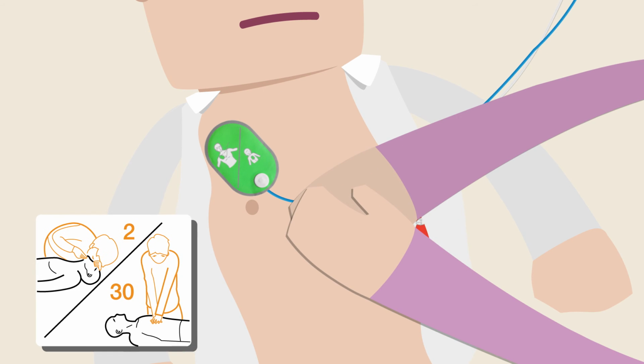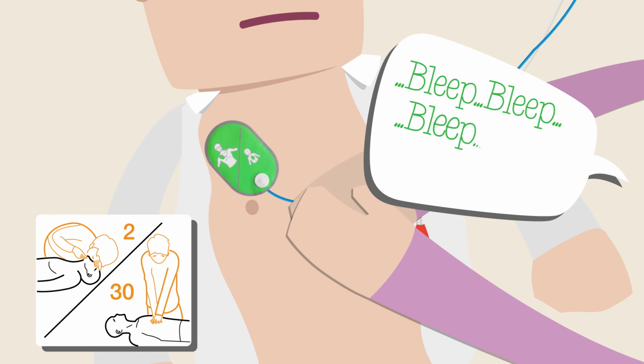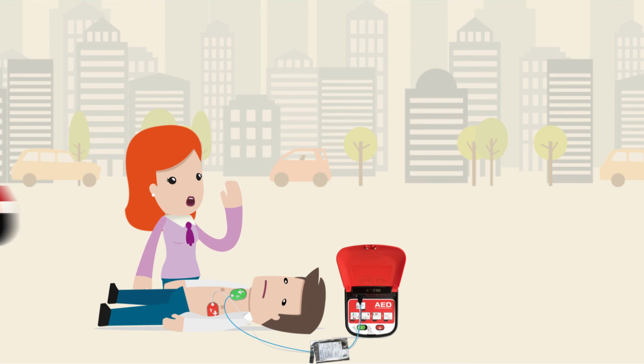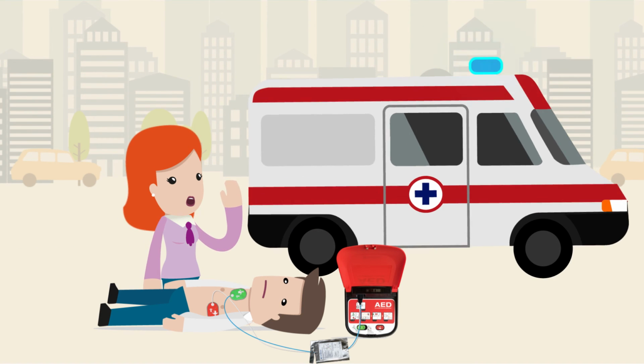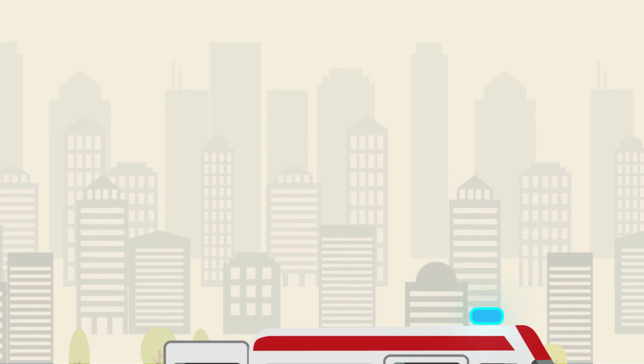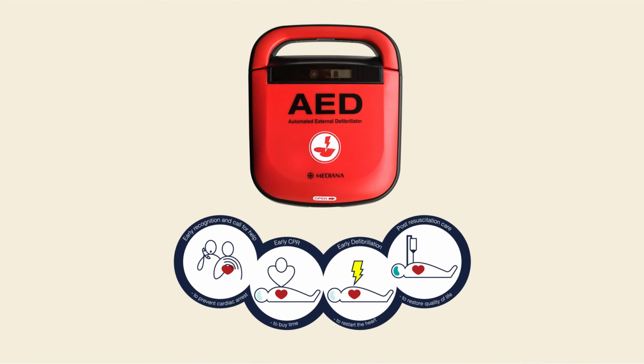After the shock, leave the pads attached and immediately resume giving CPR. The unit will sound a metronome for you to keep rhythm to. Stay with the patient until the paramedics arrive, as there's always the chance they may have another cardiac arrest. Congratulations, you now know how to save someone's life with a Mediana A15 AED.